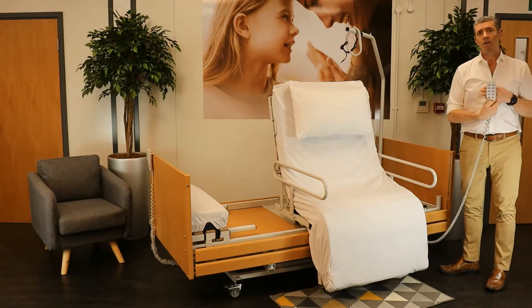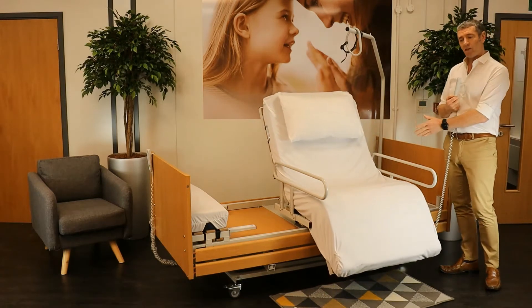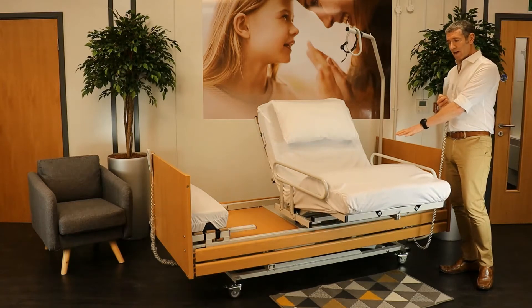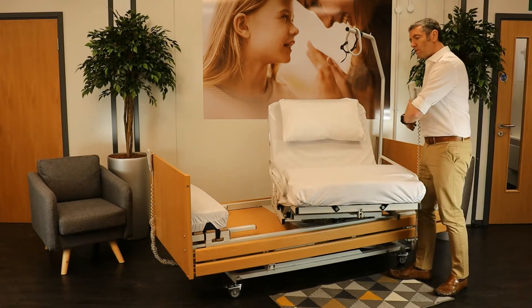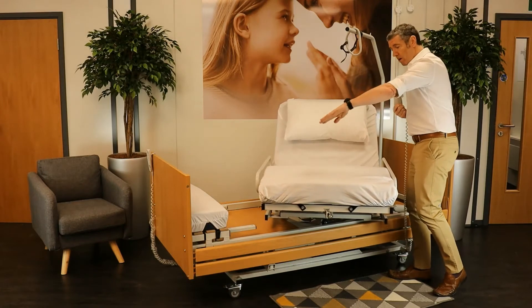By pressing one button — the in button — the bed is going to transition from being in a chair position to a recumbent, as you can see now, and it's going to start to turn through 90 degrees. I'm just following it, so it's going to make the bed now run parallel with the main side rails.